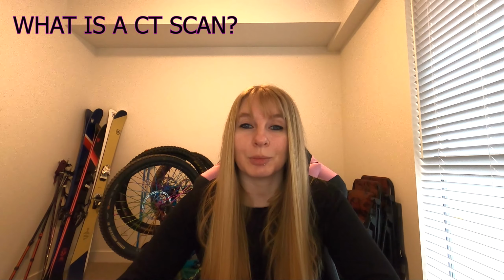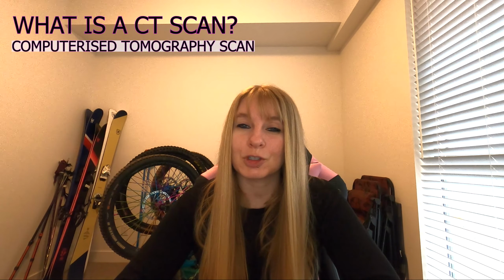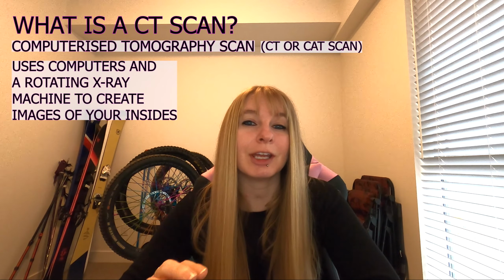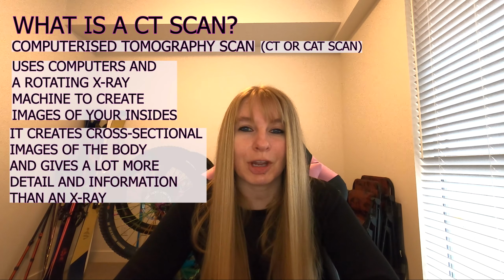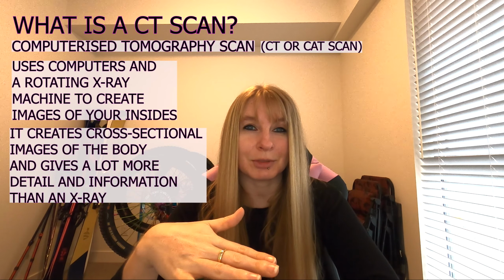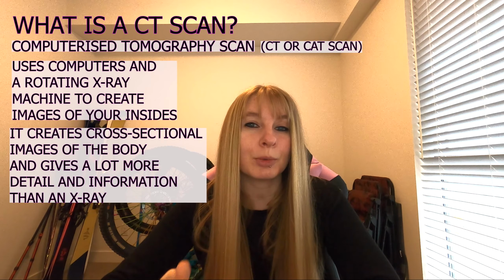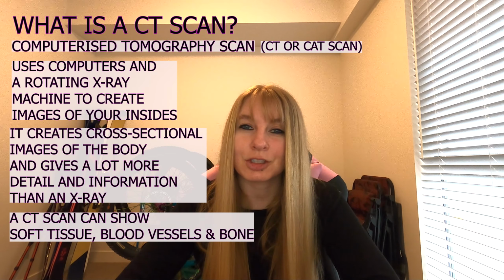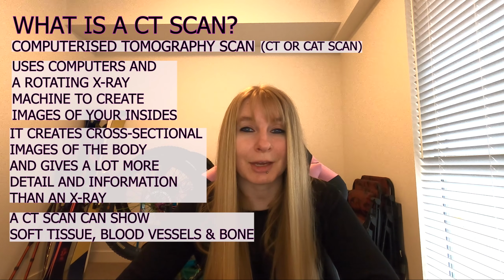Okay, so straight into it. What is a CT scan? It's a computerized tomography scan, usually referred to as a CT or a CAT scan. It uses computers and a rotating X-ray machine to create images of your insides. It creates cross-sectional or sliced images of the body, and it gives a lot more detail and information than just an X-ray. A CT scan can show blood vessels, soft tissue, and bone.